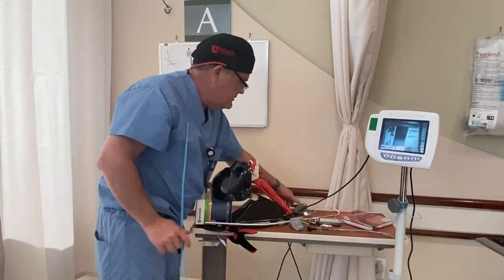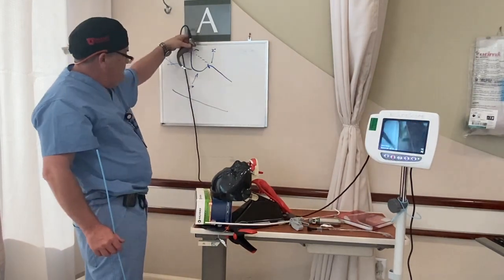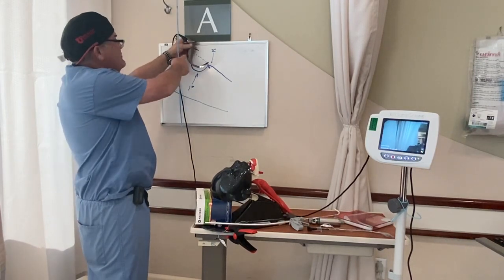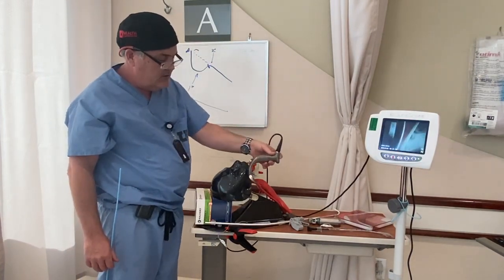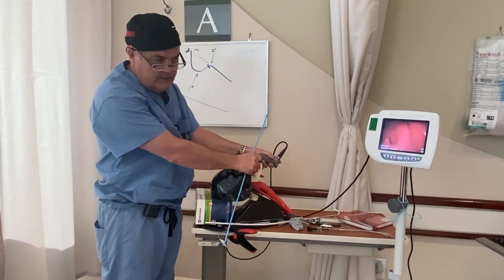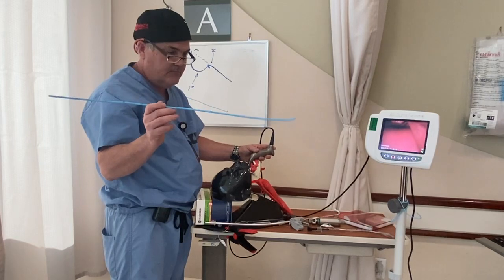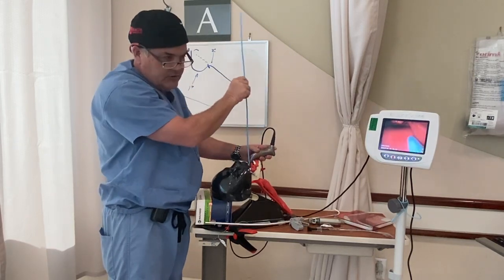The second intubation uses a hyperangulated video laryngoscopy blade. You'll see it's shaped like the primary curve — we don't change the patient's geometry with this blade. If you lift, you'll never see the vocal cords from this angle; the blade goes in and around the primary curve with very little force. I then have my residents use a bougie, and now we're going to mix serpentine geometry with linear tracheal access and see how that goes.